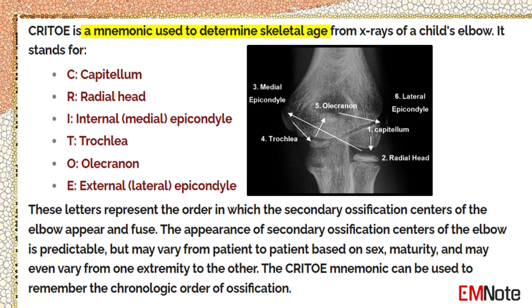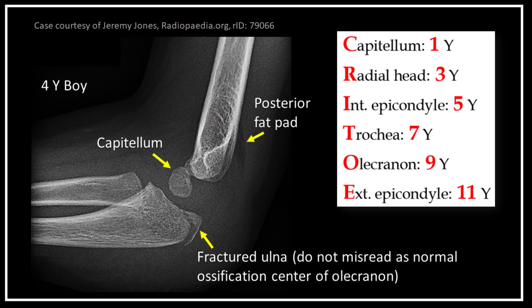The appearance of secondary ossification centers of the elbow is predictable, but may vary from patient to patient based on sex and maturity, and may even vary from one extremity to the other. The CRITOE mnemonic can be used to remember the chronologic order of ossification. In this four-year-old boy, the capitellum is well-formed and the radial head is just starting to ossify; the olecranon should not appear at this age.